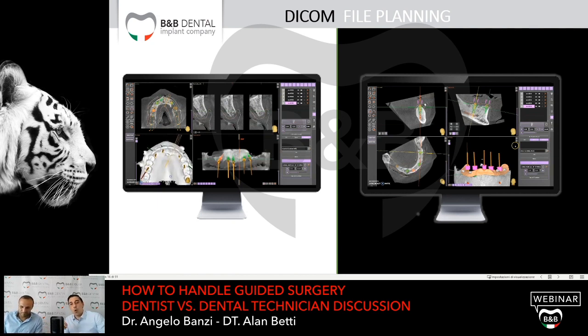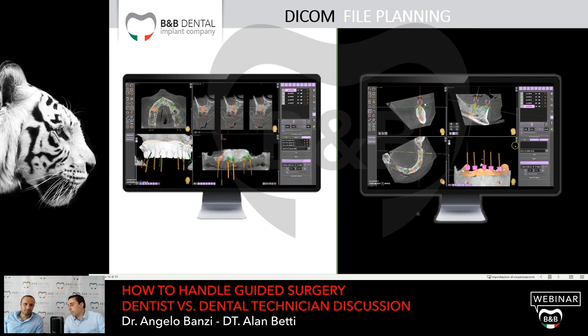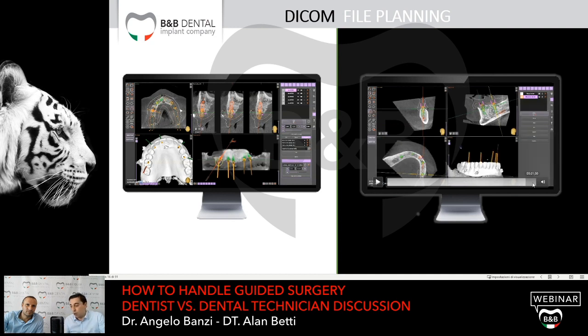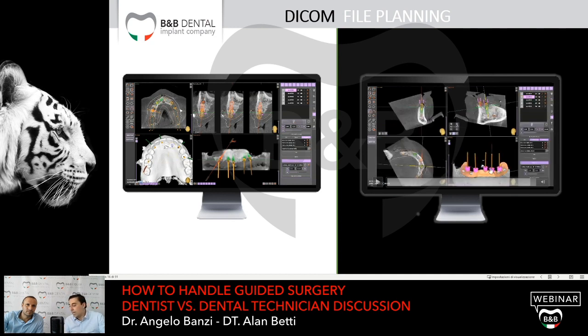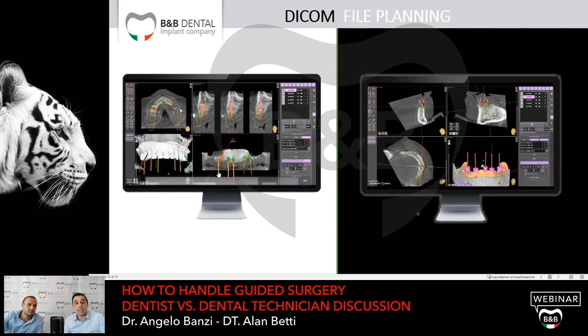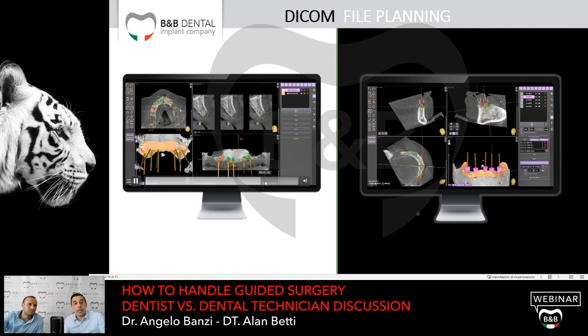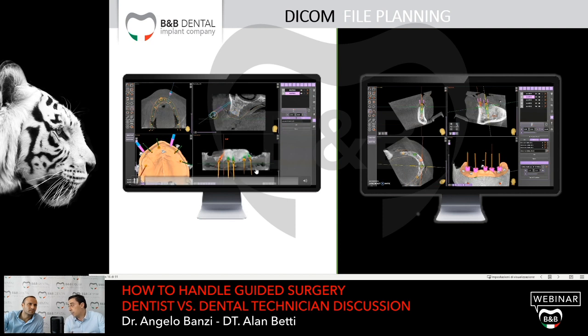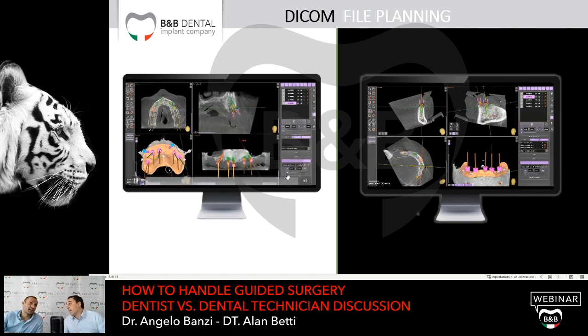If you want to open the flap, you can open the flap. It is not a problem. We can leave the sleeve in a standard position. But if you don't want to open the flap, we have solved this problem, because guided surgery was born to facilitate the clinical part, the surgery, the technical part, and the healing of the patient, the soft tissues of the patient.